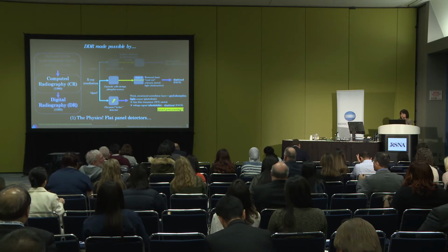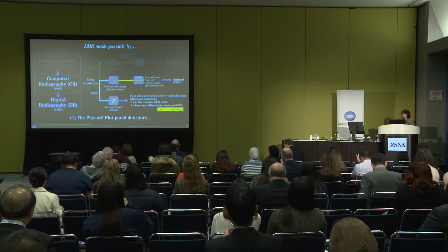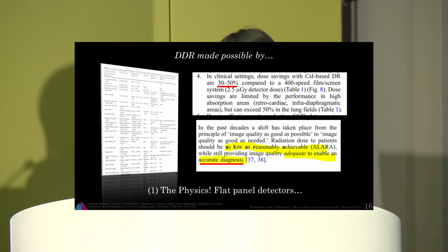Not only are you using a thick layer for good absorption, you're also able to take that digital image and, not Photoshop it, but enhance it in a way that you don't need to apply as much radiation. So you have a low dose radiograph that has much better spatial resolution. So that's technology piece number one.